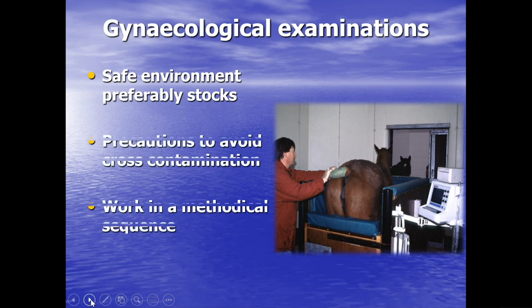Very, very important. But particularly poignant in the current time, it's a more controlled environment to allow you to avoid cross-contamination and transmitting disease around the place. So the fact you've got the mare restrained in stocks allows a much more controlled environment. And with that controlled environment comes the ability to work in a methodical sequence.